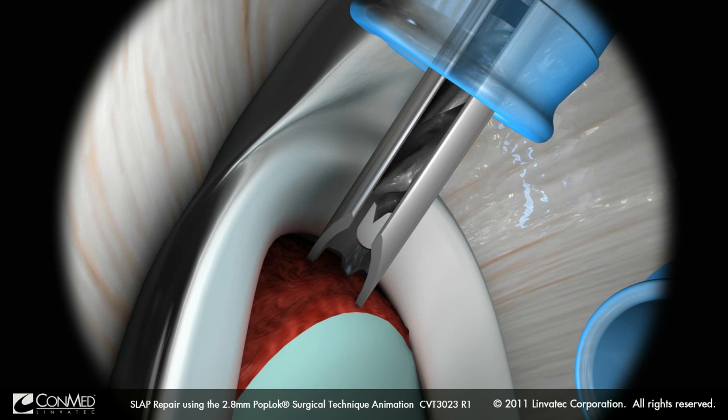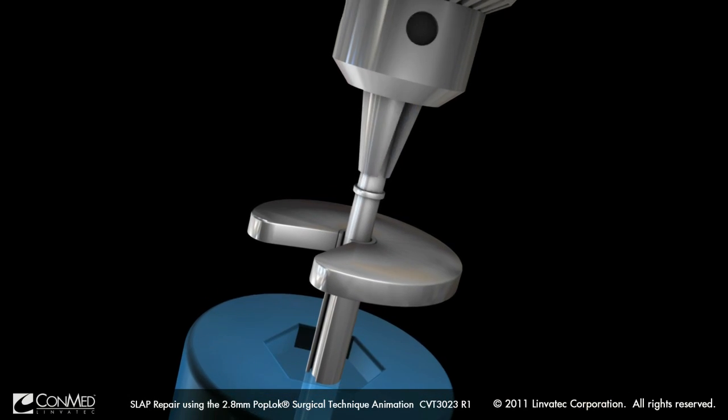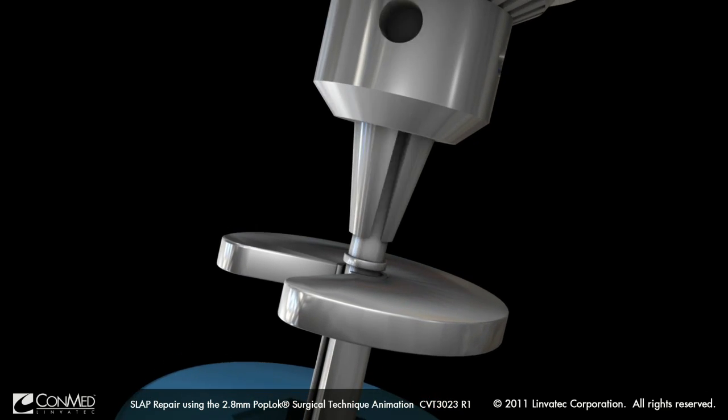Proper depth of the hole is both indicated by the distal laser line on the drill bit and ensured by the proximal depth stop when contact is made by the drill bit on the guide itself.